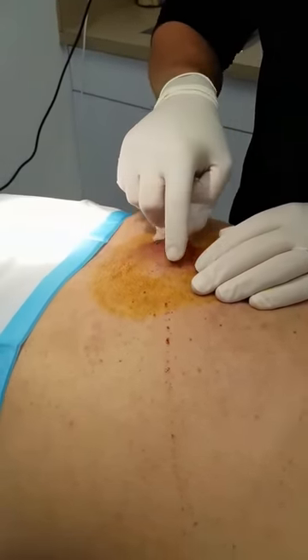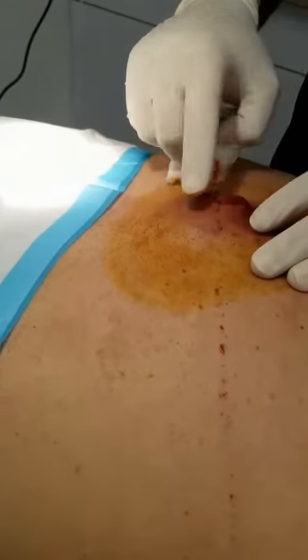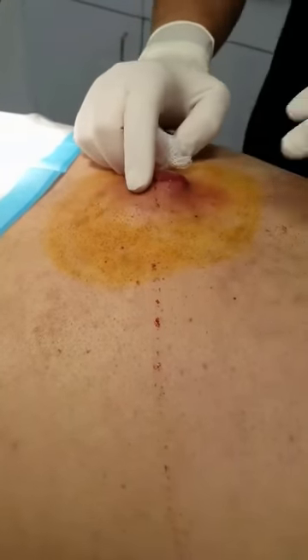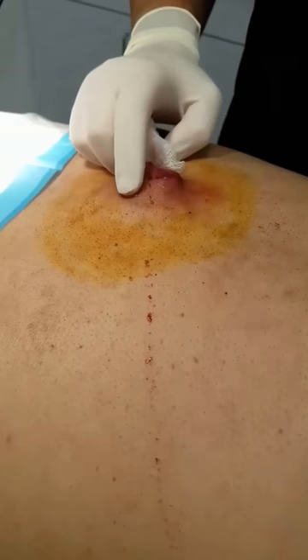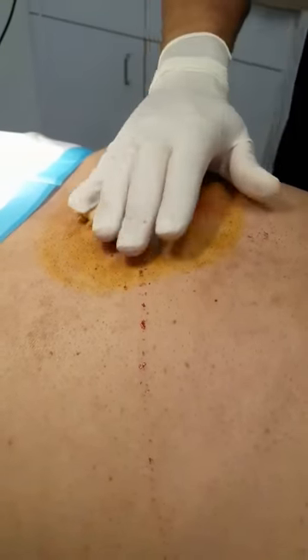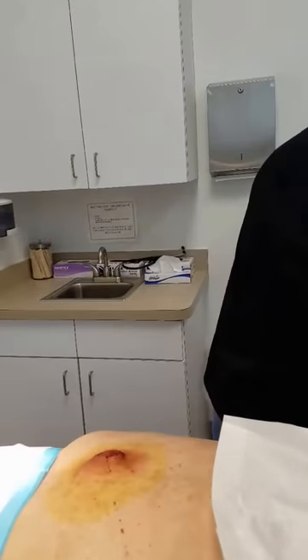You can see some of the blanching from the epinephrine right through here. Does it feel a little numb? Not really. We'll give you a little bit more numbing medicine until you don't feel it anymore. Okay, numb the patient up again.